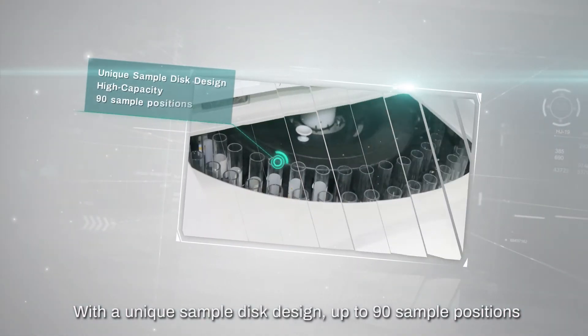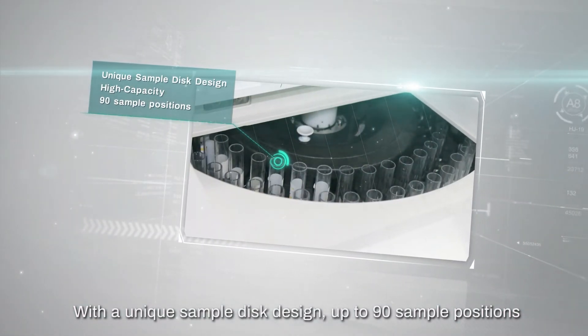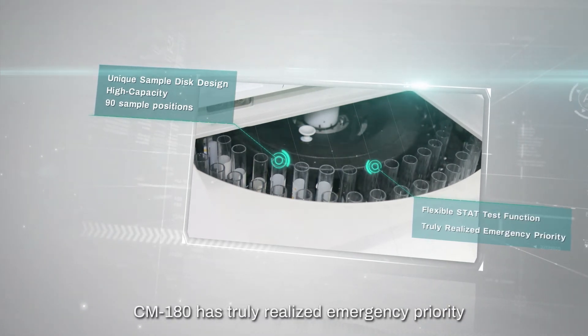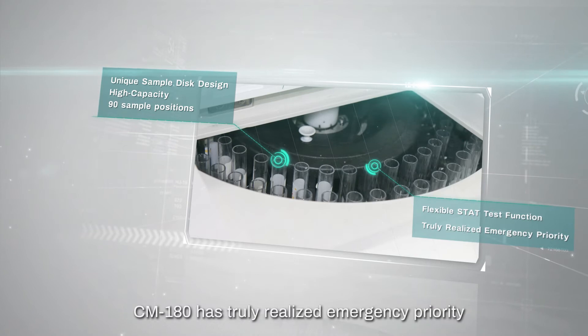With a unique sample rack design, up to 90 sample positions, and a flexible stat test function, CM180 has truly realized emergency priority.